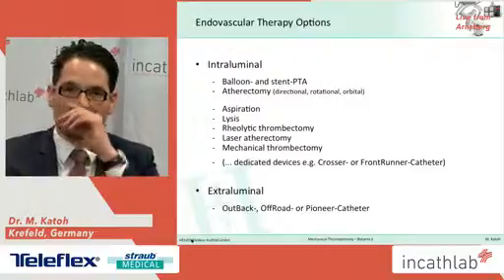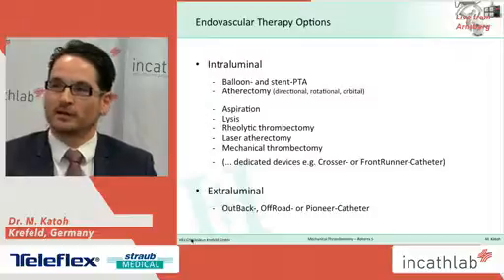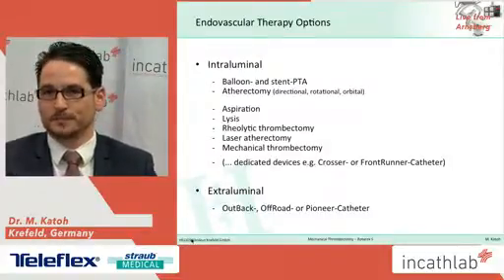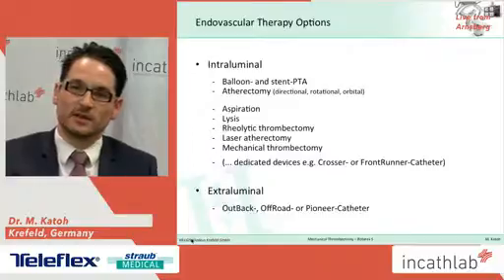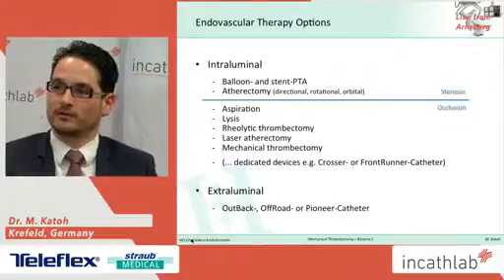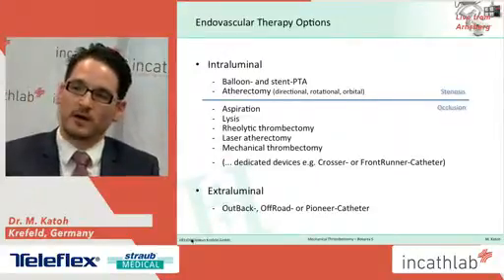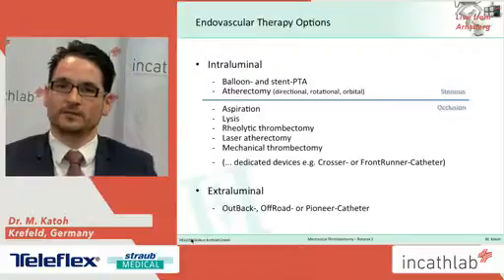This can be tackled by surgery, by lysis, or nowadays by endovascular therapy options. These can be subdivided into intraluminal or extraluminal approaches, and balloon and stent PTA techniques as well as atherectomy devices are particularly indicated for stenotic lesions, while for occluded vessels aspiration, lysis, rheolytic thrombectomy devices, laser atherectomy and mechanical thrombectomy are available. All of them have their own advantages and disadvantages.